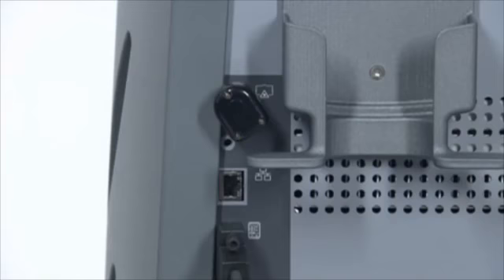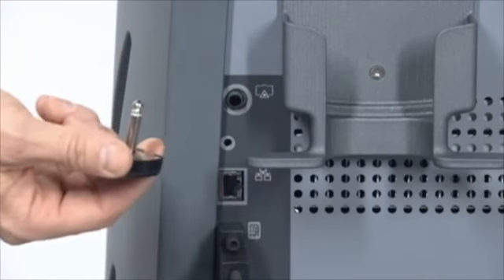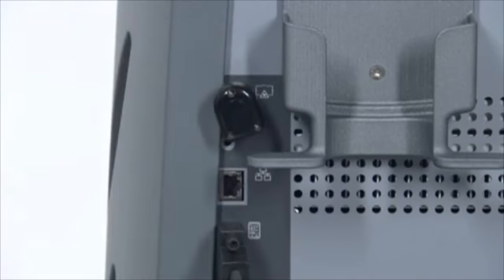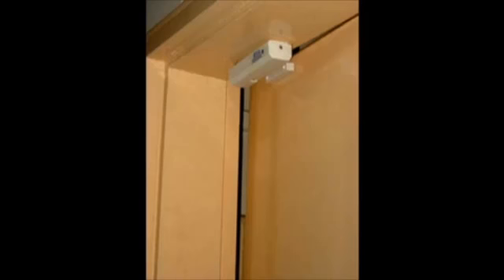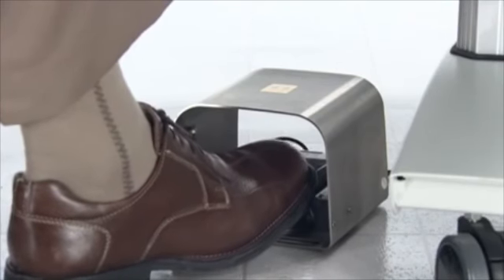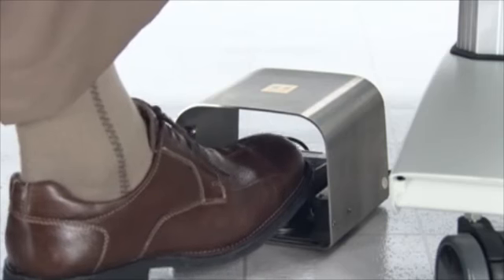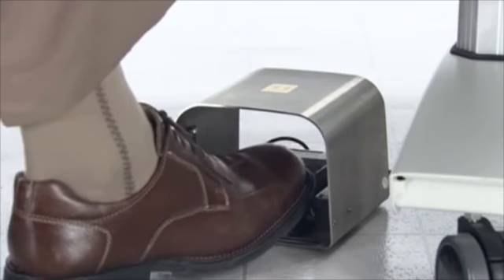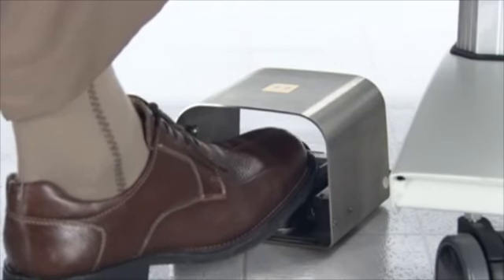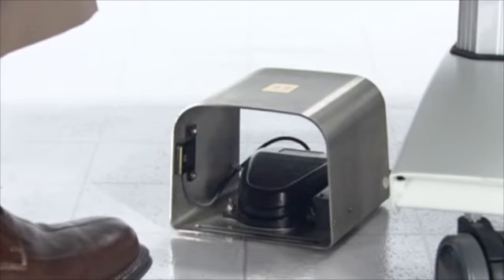The external door interlock plug must be inserted into the external interlock receptacle on the rear of the laser console for the laser to operate. The plug may be wired to an external switch to disable the laser if the treatment room doors are open during treatment. The foot switch activates the laser treatment beam when you depress it while the laser is in ready mode. If you are using the smart foot switch, it engages the automatic eye safety filter when you place your foot inside the foot switch housing while the laser is in ready mode.